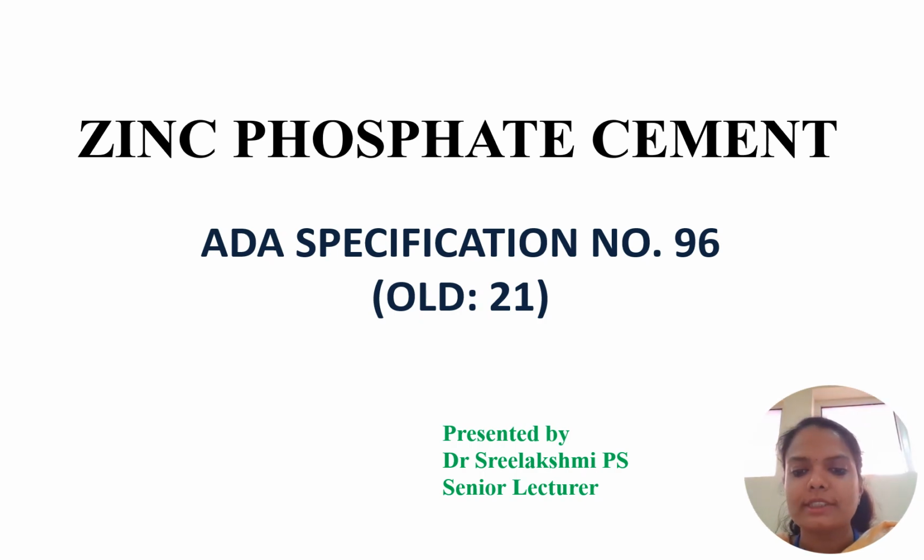Good morning. I'm Dr. Srilakshmi PS from the Department of Conservative Dentistry and Endodontics. I'm going to discuss zinc phosphate cement. The ADA specification is number 96.